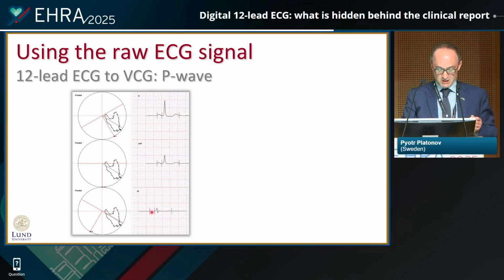It gives you a certain shape. You see this little notch at the end of the P wave, like here and here. It gives a very clear pattern on the surface ECG. Biphasic P waves in inferior leads usually are considered signs of advanced intra-atrial block.